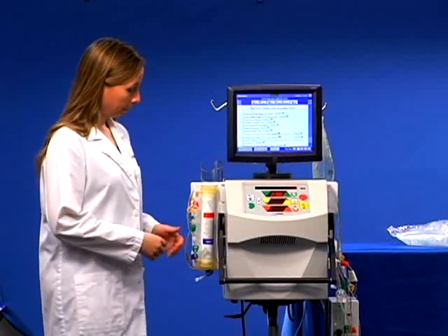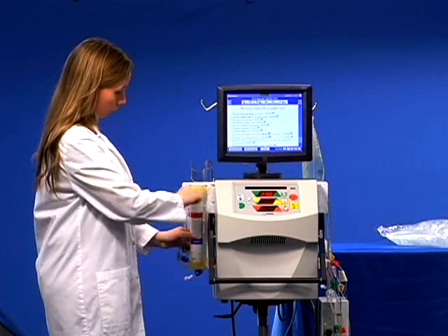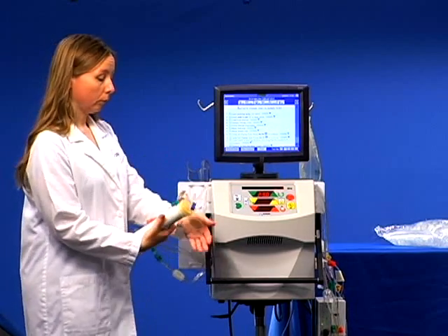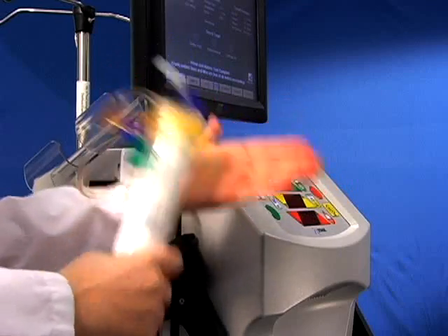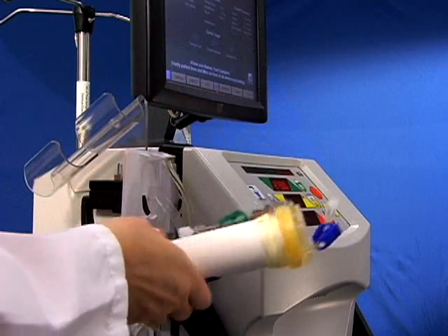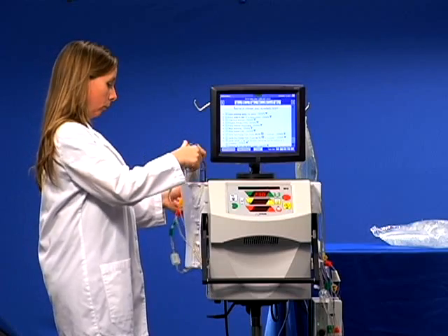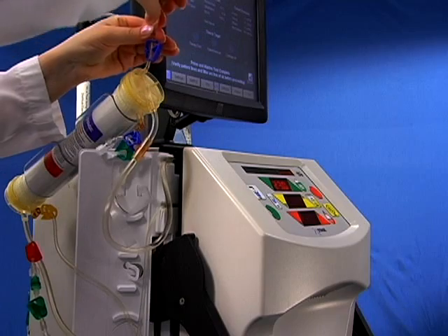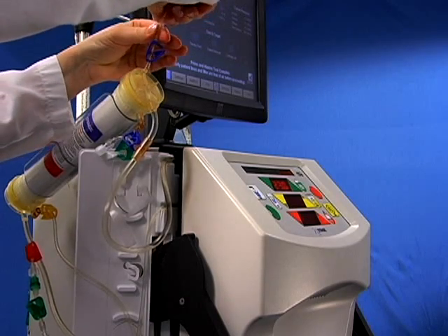Locate the filter on the left side of the cycler. Remove it from the cartridge and then gently tap the filter using the palm of your hand several times. Place the filter in the filter holder with the post filter port upright. Prime the post filter ports.